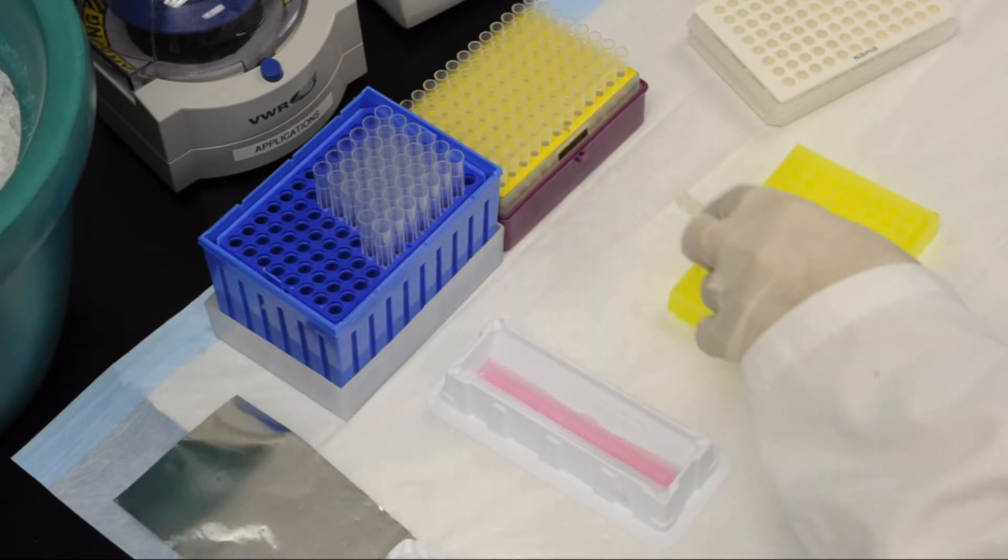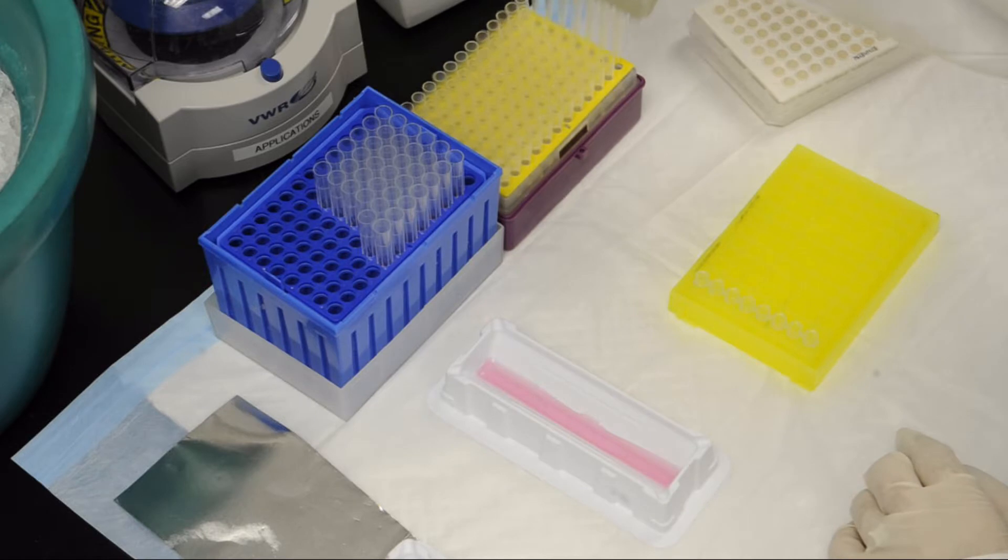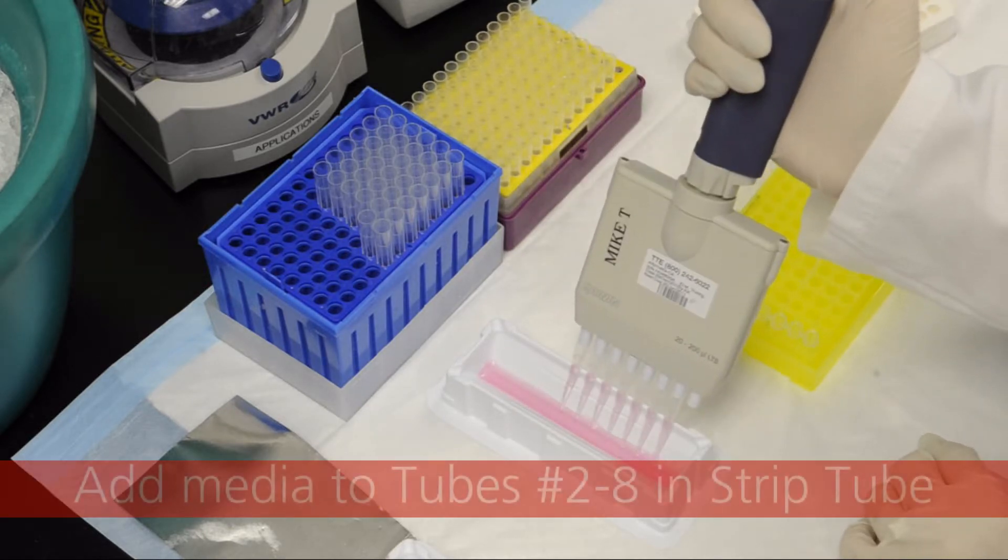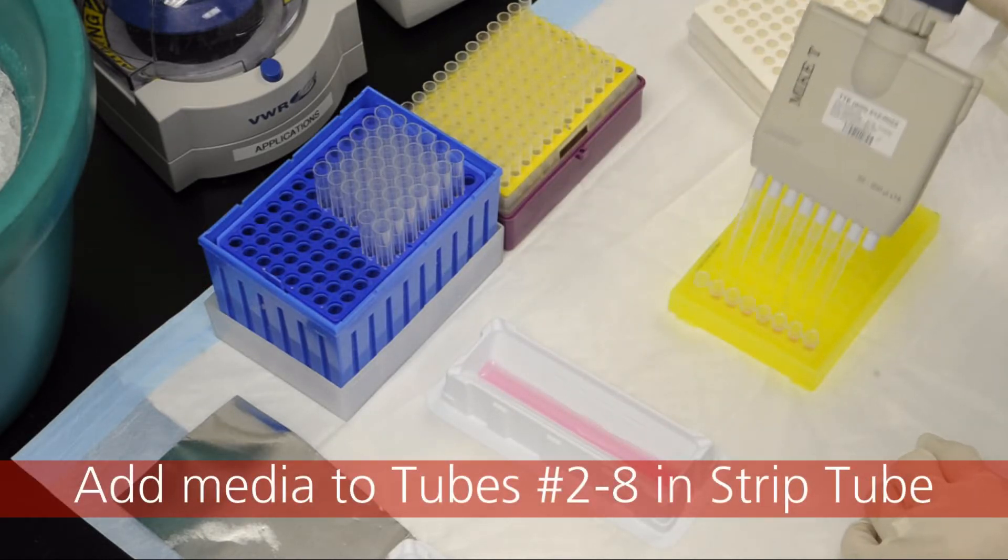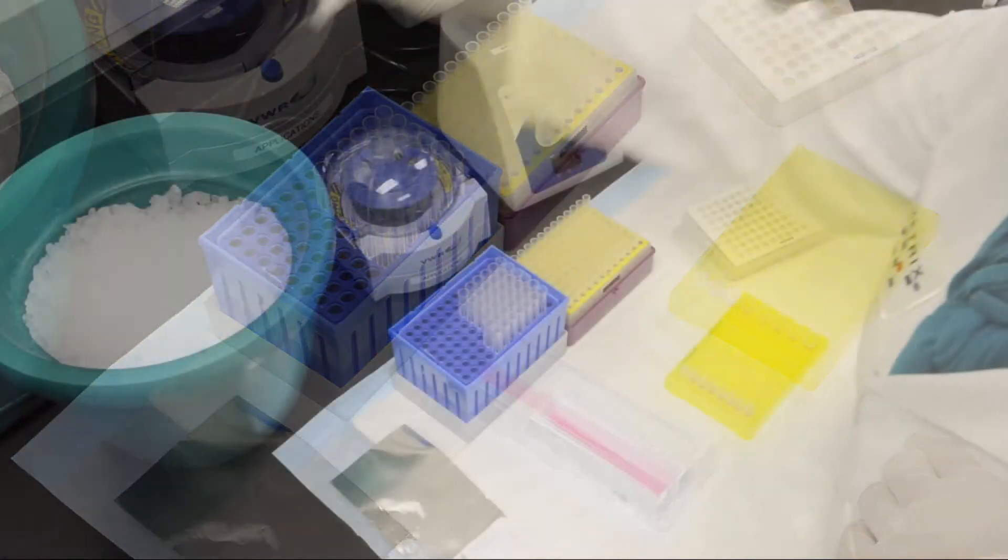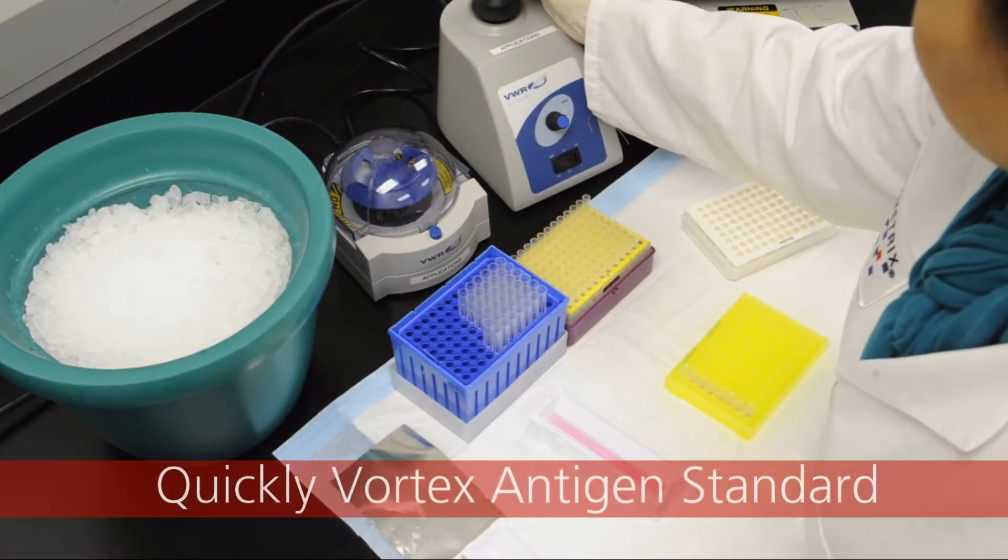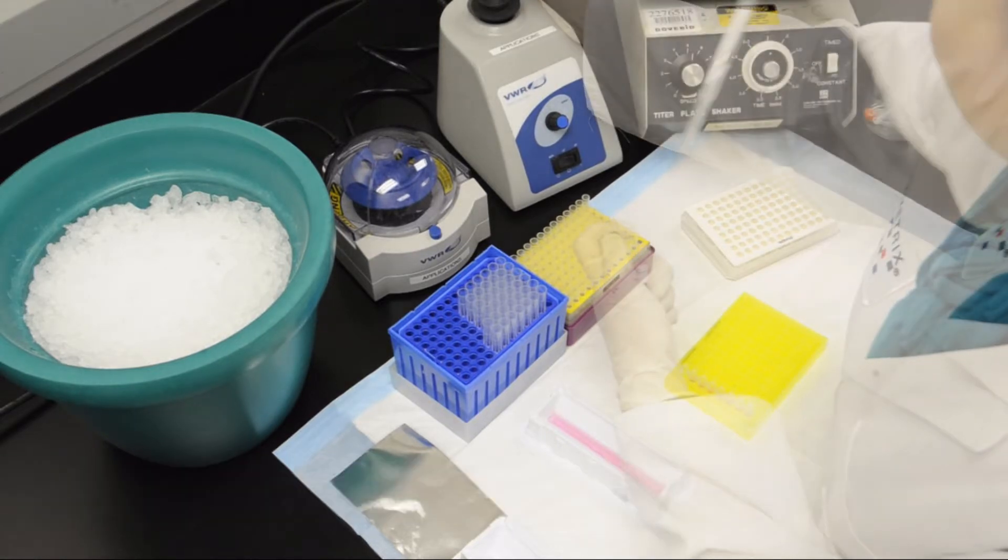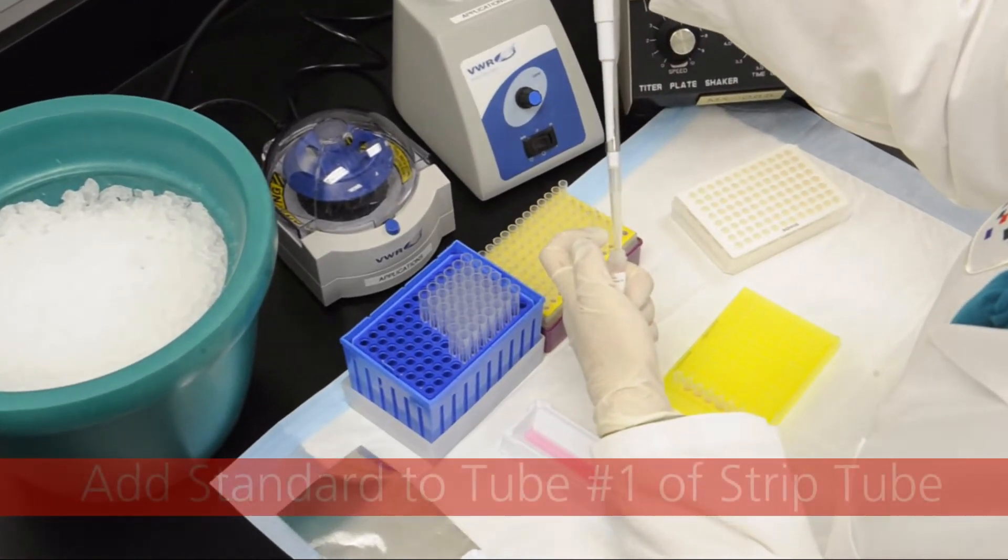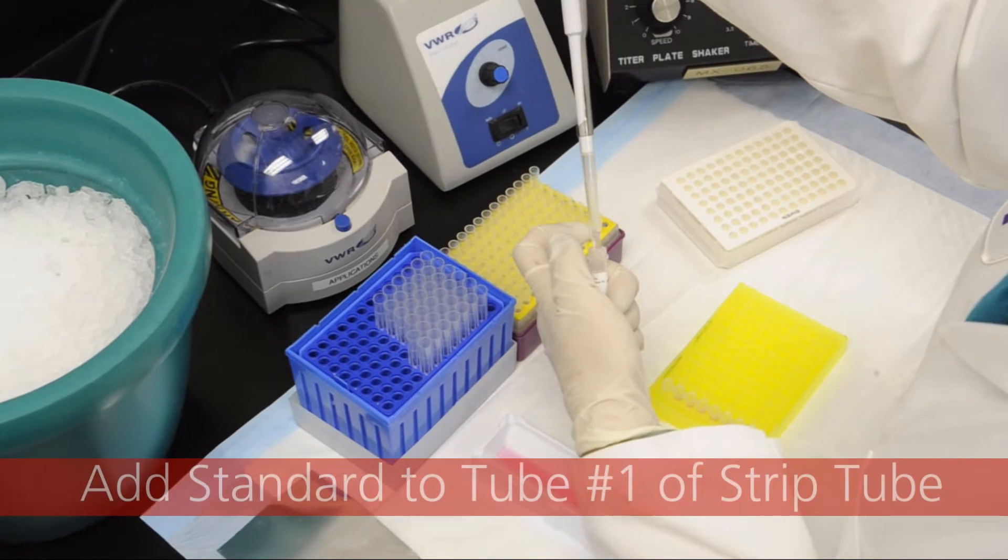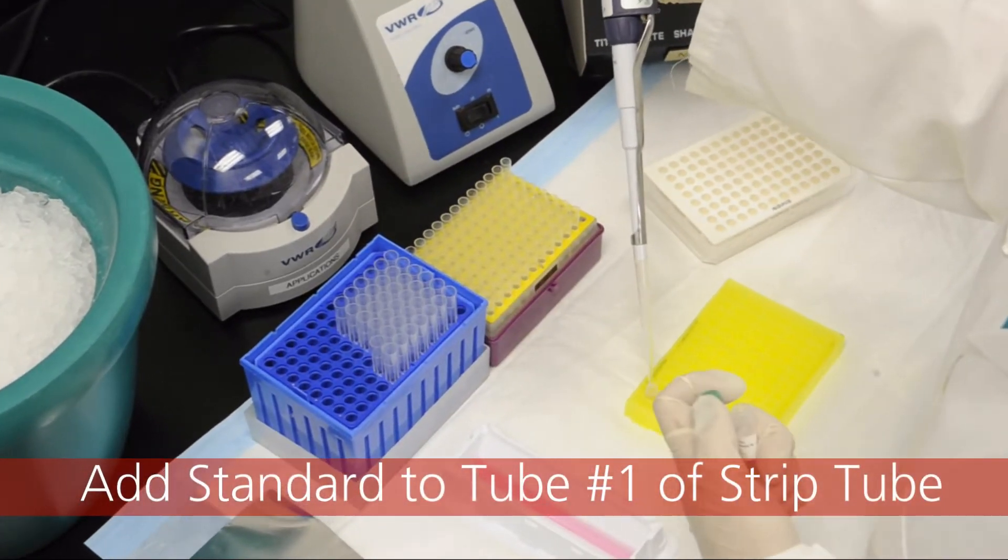Using a reservoir and a multi-channel pipet, add 200 microliters of media to tubes 2 through 8 of the PCR-8 tube strip. Pipet the contents of the antigen standard into tube 1 of the PCR tube strip.